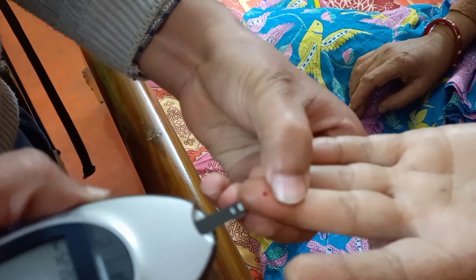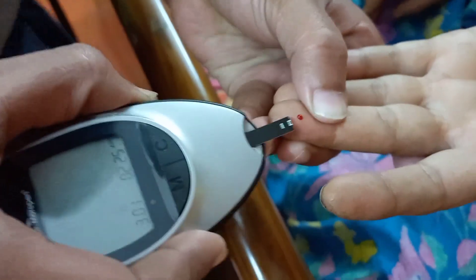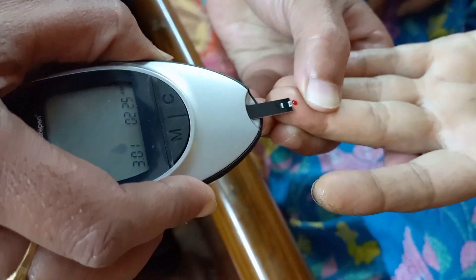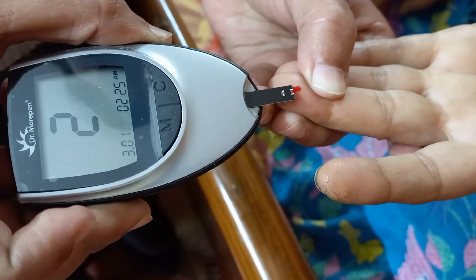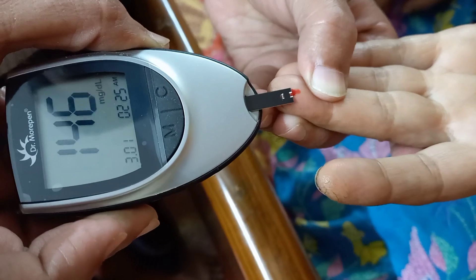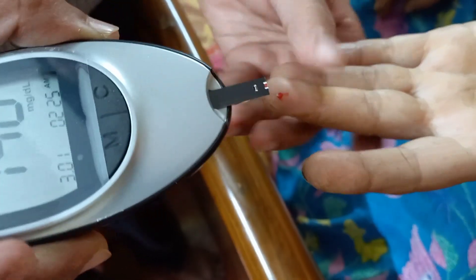Now the blood has come. Put the monitoring strip on the blood to obtain the result. This is the result of the present blood sugar.